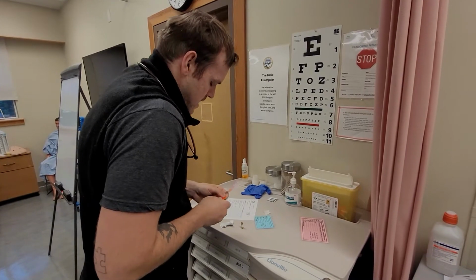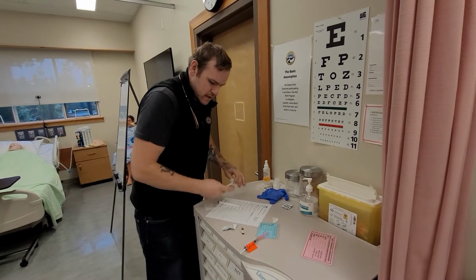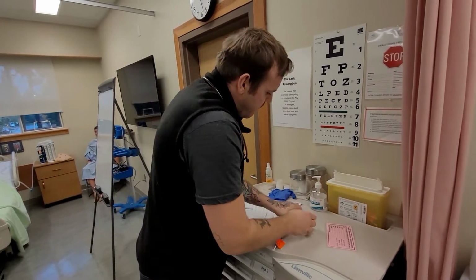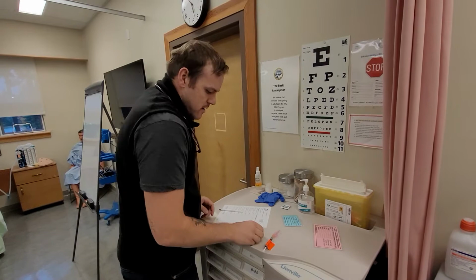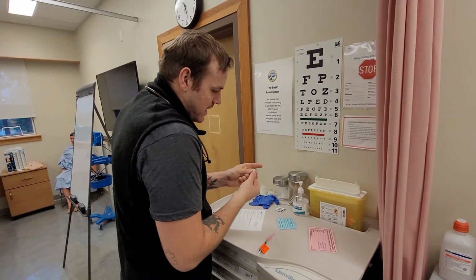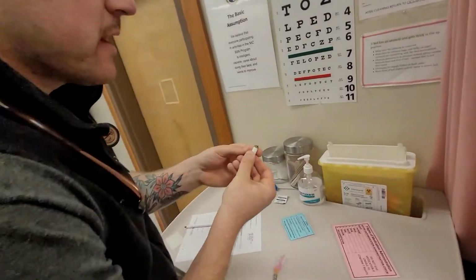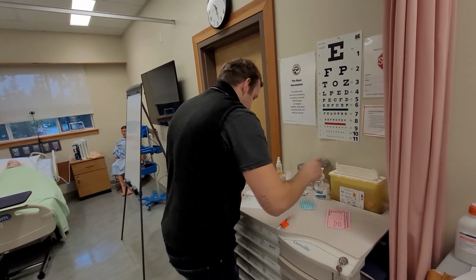So that's all ready to go there. We've got that prepped. I'm just going to clear my workspace of some garbage. Okay, and now we're ready for our final check. That's returning the medication to the drawer or discarding. So we're going to waste this, and we're going to make sure that we have somebody else to see that we are wasting the narcotic into the sharps. Before we do that, we're going to check expiry 12/20/30. Morphine, perfect. We can discard that right there.